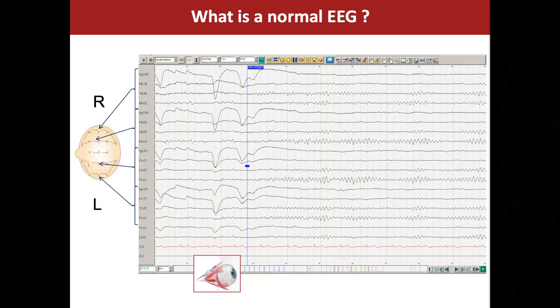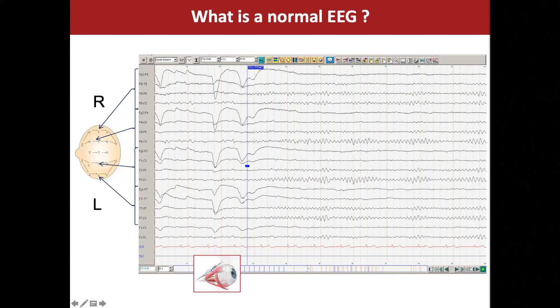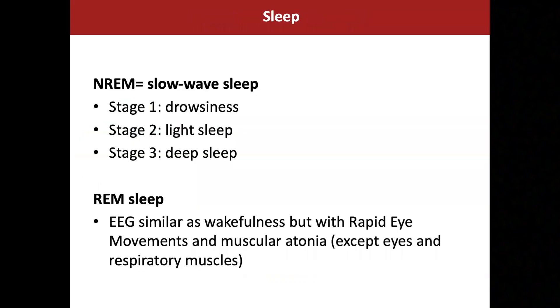A normal EEG shows the right side of the brain in the upper channels and the left side in the lower channels. You can see alpha rhythms in the posterior electrodes that are attenuated by eye opening. There is a nice posterior-to-anterior gradient, nice free activity, and no slow activity when viewing 10 seconds per page. This is how EEG looks in clinical recording during wakefulness; in sleep, the EEG changes a lot.